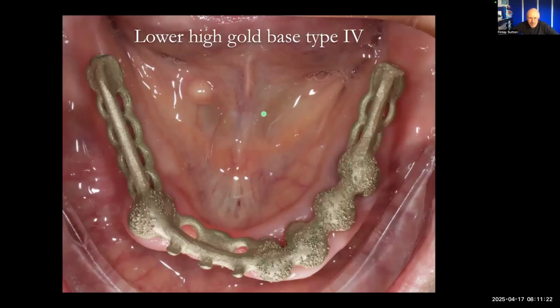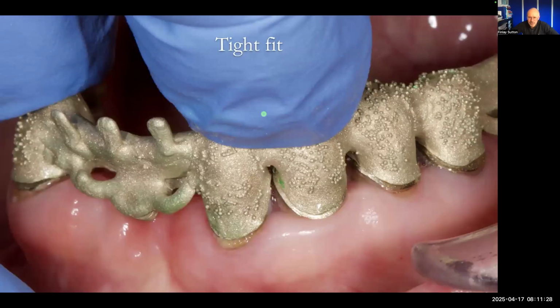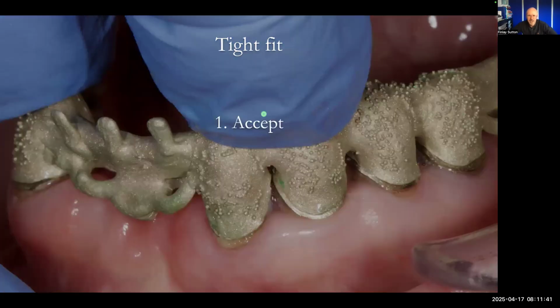When I tried that in, it was pretty tight. So it wasn't as good as the upper. It was a little bit tight. So I could push it down, but it was almost like wedged onto those teeth. So I had to think about this. Do I accept it's tight? This is super important, my thought process. Do I accept it's tight and then finish it and then allow it just to settle in? Because with all of those natural teeth there, with their own periodontal ligaments, they will shift a little bit and just slot in, like orthodontics. So do we accept that?